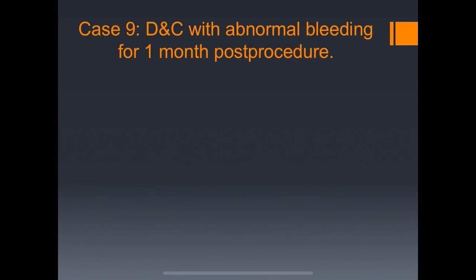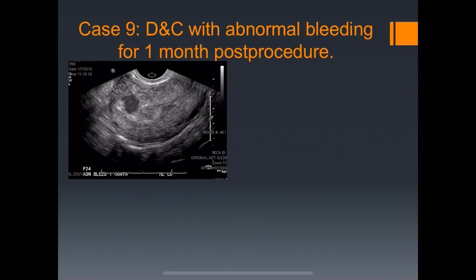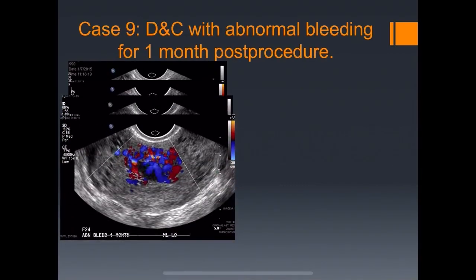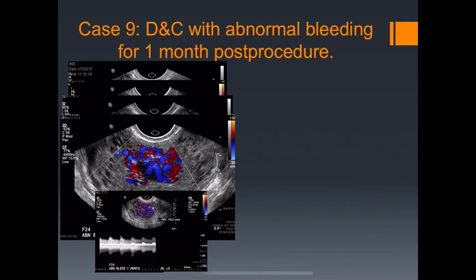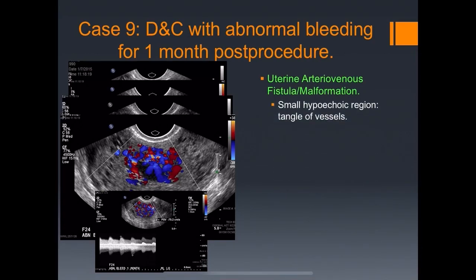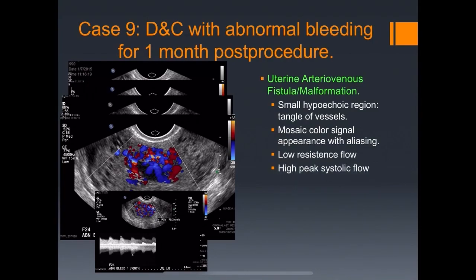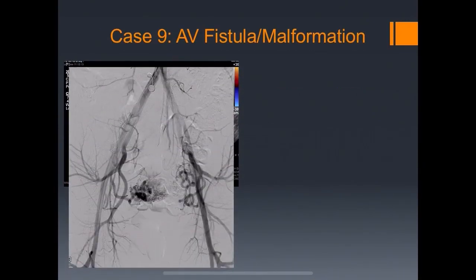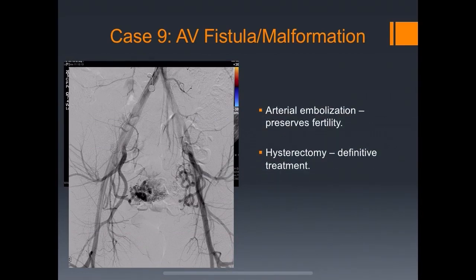DNC with abnormal bleeding for one month post-procedure: there's a hypoechoic structure not in the endometrium but within the adjacent myometrium — very hypervascular with multiple tangled vessels. The waveform shows high-velocity, low-resistance flow. This is a uterine AV fistula or malformation, presumably secondary to the procedure. Features include a small hypoechoic region with mosaic color signal and aliasing, and low resistance with high peak velocities. This must be diagnosed correctly — performing a DNC mistaking this for retained products could cause life-threatening hemorrhage. The patient was embolized, which preserves fertility, though hysterectomy is the definitive treatment.